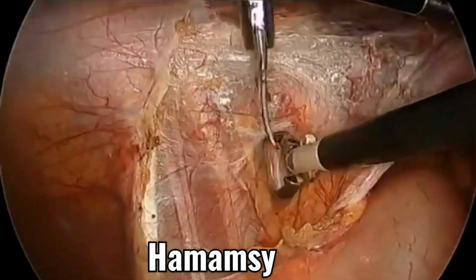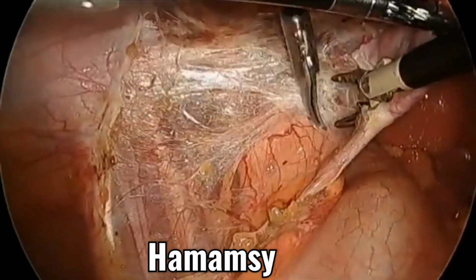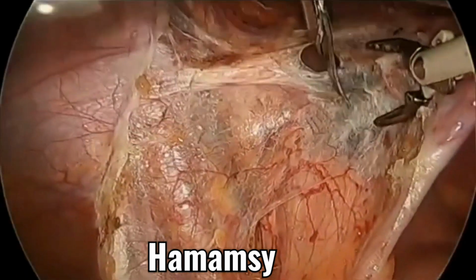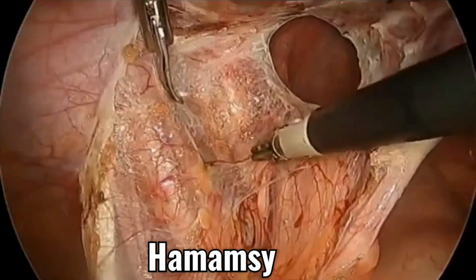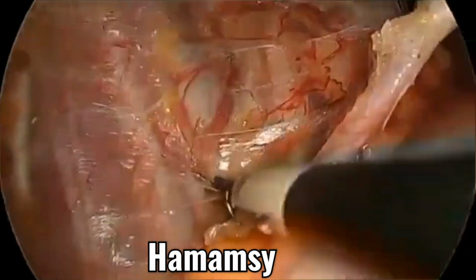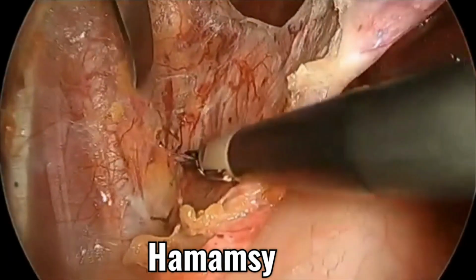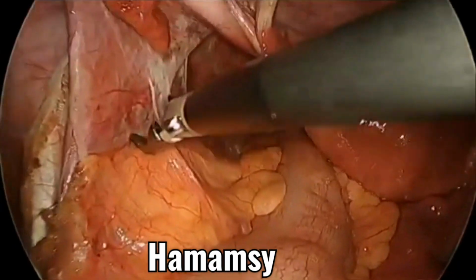Rule number 4 in laparoscopic pelvic lymphadenectomy, which is very important: the fatty tissue is your friend. Okay, you do a natural dissection. You can go through the gray zones, through the peritoneal dissections in a sweeping manner using a simple bipolar and the cold scissors. وانا رايح فين ما انا راجع تاني.